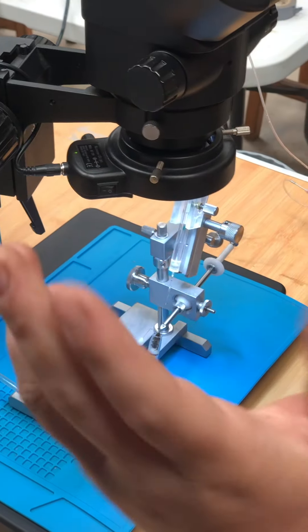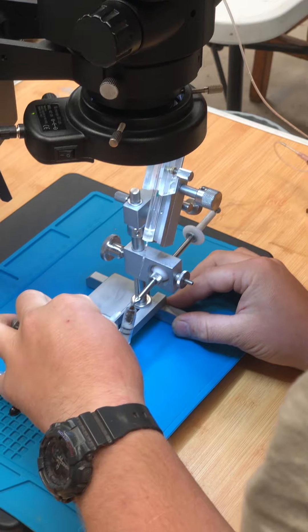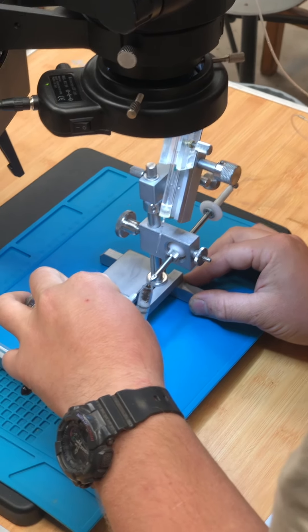So it's all about just leaving her open bit by bit. Then bring your ventral hook back, and then you just pull the ventral side open. So what we've done with the ventral hook is we've pulled it in, and we've pulled open the abdominal opening this time.